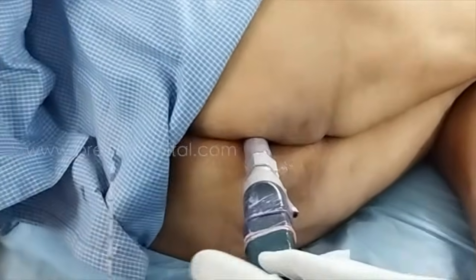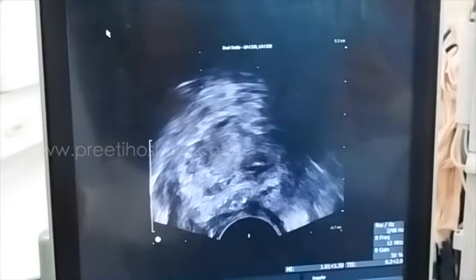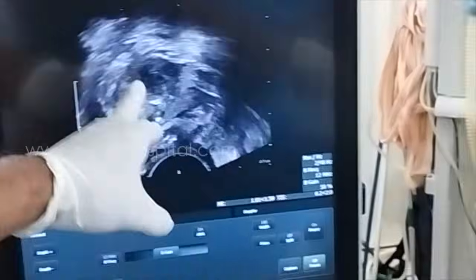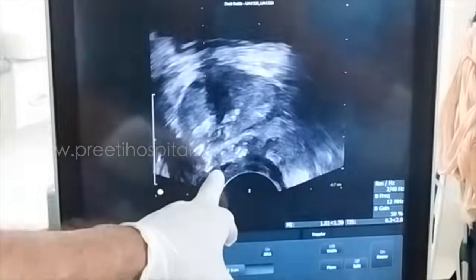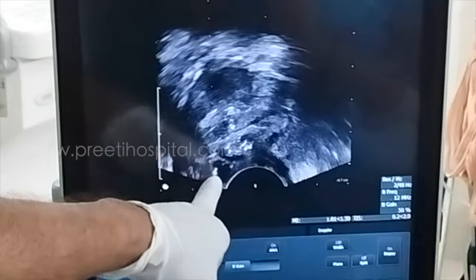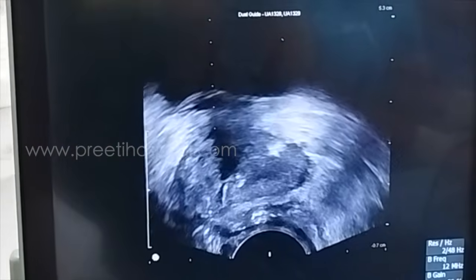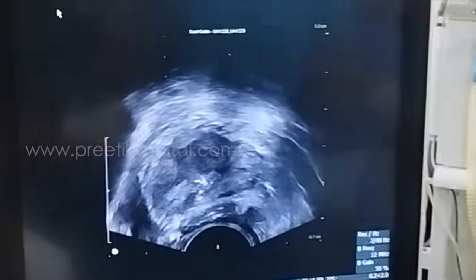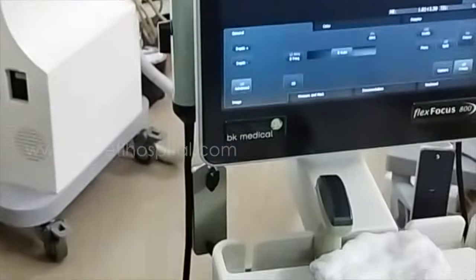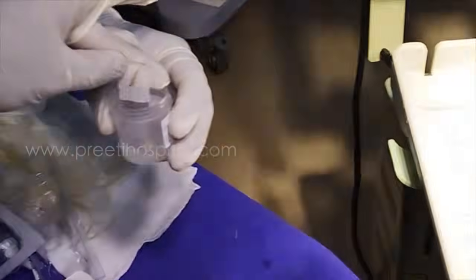Now coming to the same paramedian. Here the urethra can get injured. Then bleeding can happen because you will be close to the urethra. Now para-urethral, this is the urethra, this is the para-urethral region, insert up to here. See here it is the rectal mucosa, come back, right, fire. Here the patient will sometimes have a little pain, because you will be tilting towards the anus. See, this has come a big good piece. Because of the pressure the patient may have pain.